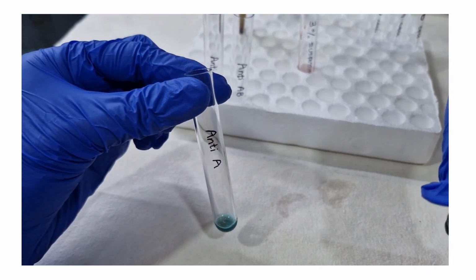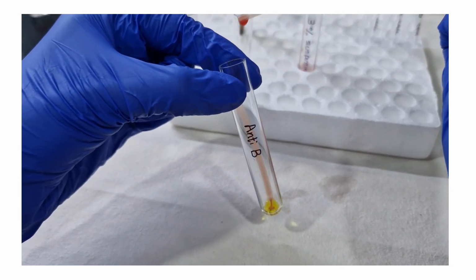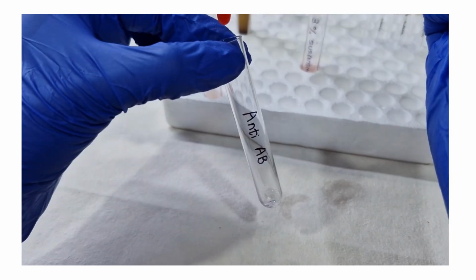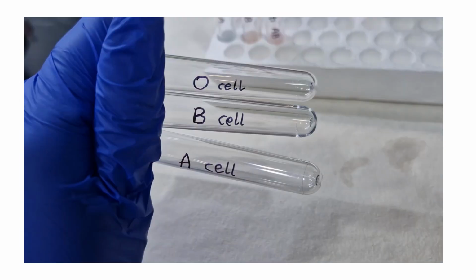We will add 1 drop of 3% red cell suspension to all the 3 test tubes of forward grouping. Gently shake the tubes to mix the contents thoroughly.